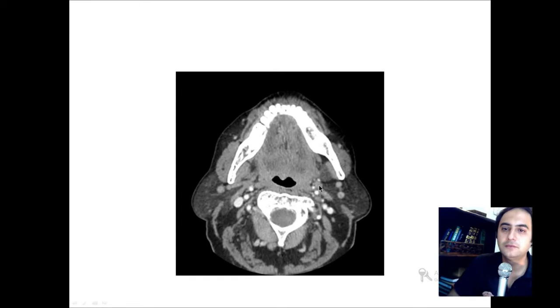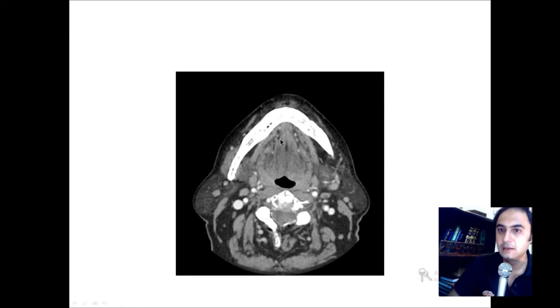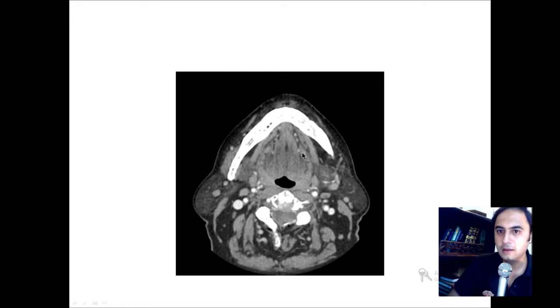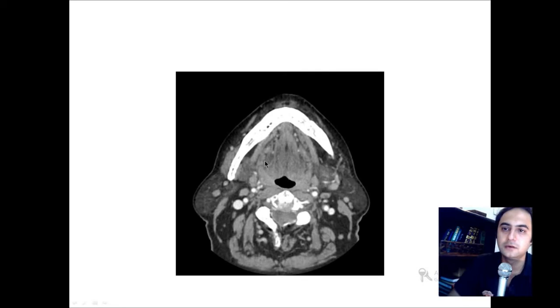These are the posterior belly of the digastric. Now here you can differentiate between the muscles of the tongue. On the lateral aspect, you see an elongated shadow — this is the mylohyoid muscle. In the midline is the genioglossus muscle. And here you see a curved muscle — this is the hyoglossus. So to summarize: the hyoglossus is the curved one, the mylohyoid is the lateral elongated one, and here is the genioglossus in the center.